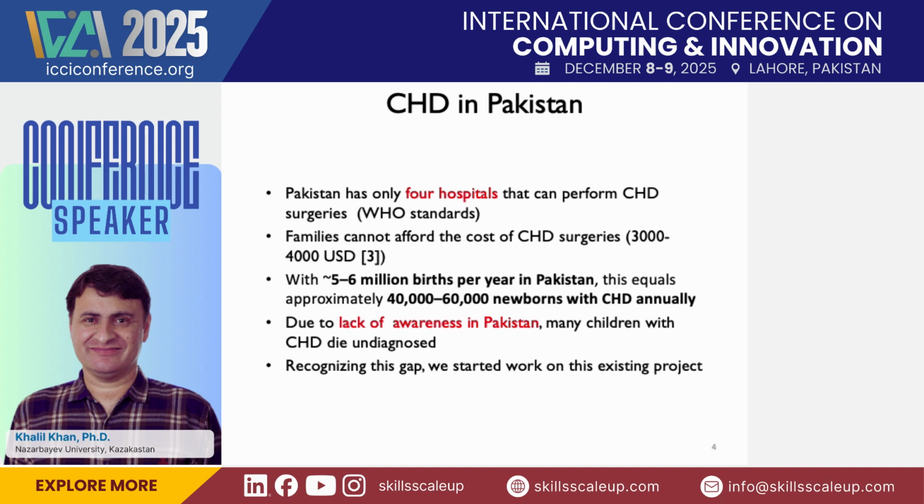Another main problem is the lack of awareness in Pakistan, specifically in the rural areas, in the areas which are far from the cities. Since we don't have specialized doctors in those rural areas, normally the kids die due to CHD without being diagnosed properly. Recognizing this gap, we started work on this exciting project about 4 years back, and still we are doing research. We are trying to develop an AI stethoscope which can detect CHD specifically in rural areas, in areas which are far from the cities.